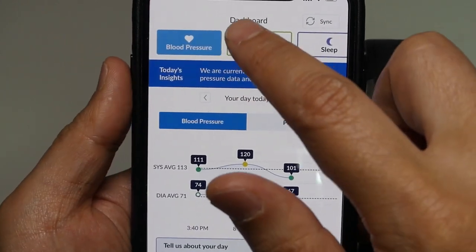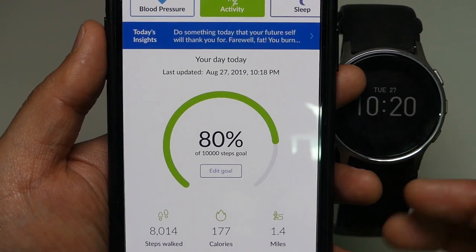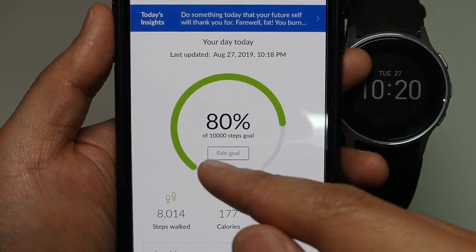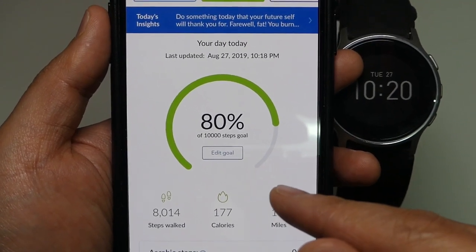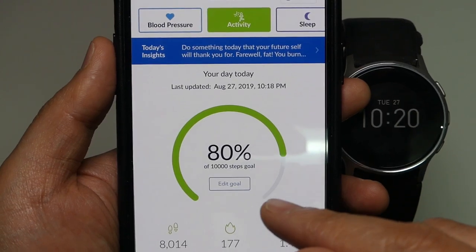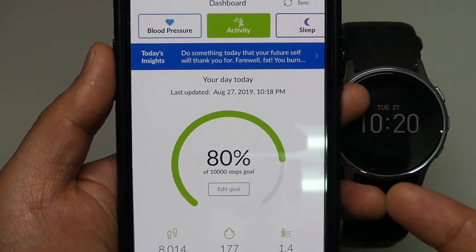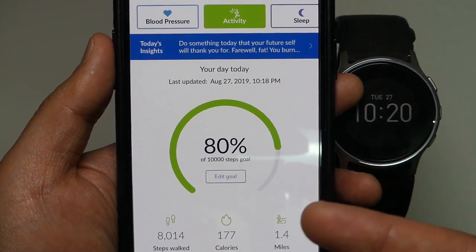And secondly, it allows me to set up a goal. For example, I can set up a goal that says 10,000 steps. So I have to walk in one day to try to achieve the 10,000 steps. And I don't achieve it very often, but at least it motivates me to do so.